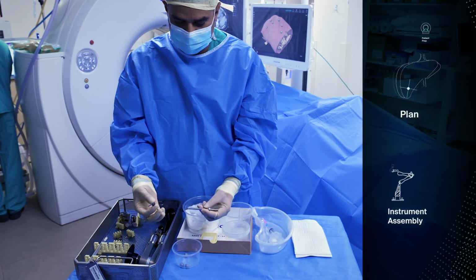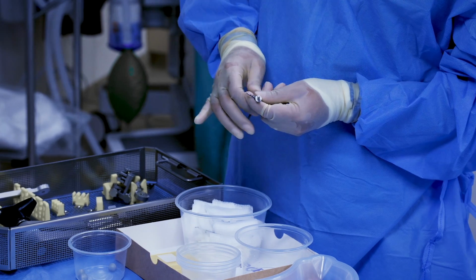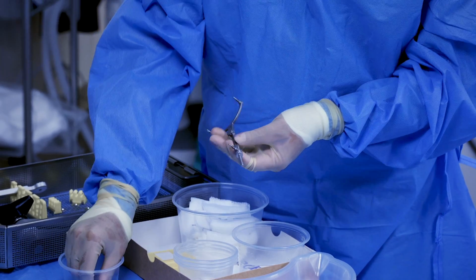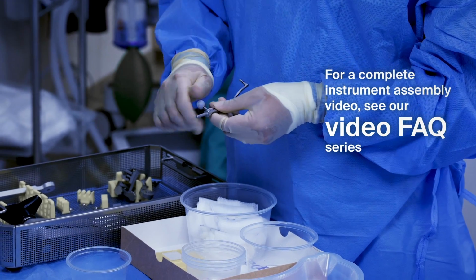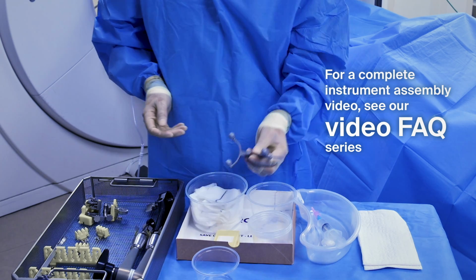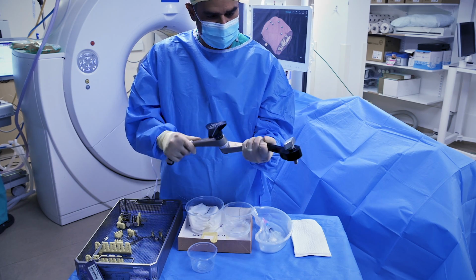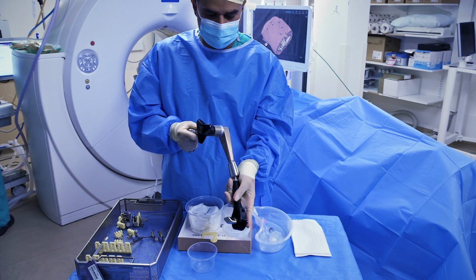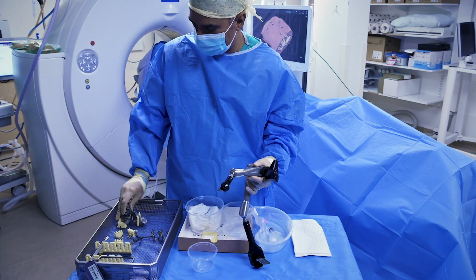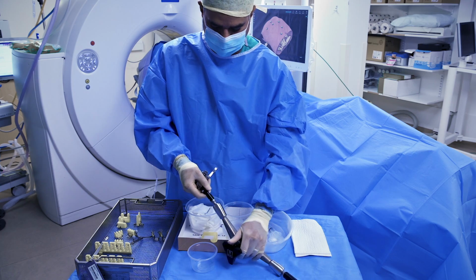We'll put together the aiming device. And once we've put that together, we'll put the reflective stereotactic markers on the 3 prongs here. So we now have an aiming device with stereotactic markers on. This is the mechanical arm that is going to attach to the patient. This will attach to the board on the side of the bed, and our actual aiming piece of equipment, which is here, needs to be connected onto this piece here.